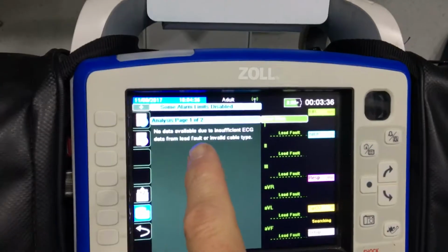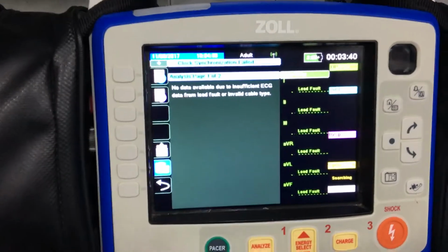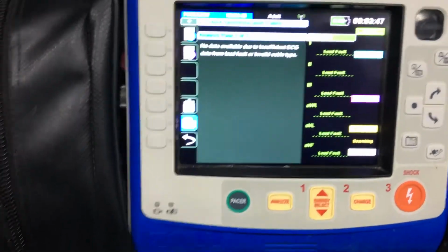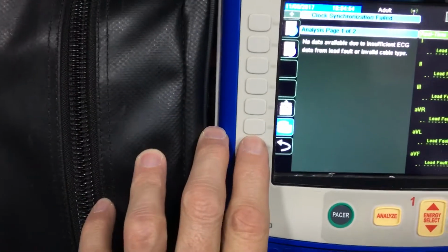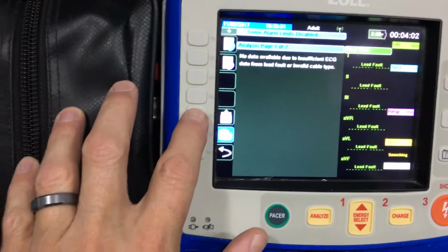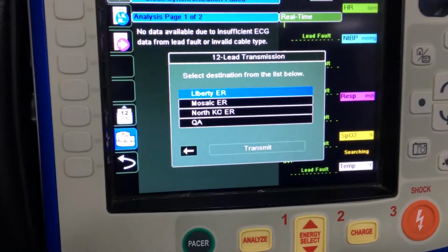So this box here that gives you information on your specific patient, on if it's a STEMI or if it's normal, whatever it says, do not erase that yet. Hitting this button here erases your info screen and just brings up your full 12 lead. If you exit first, you cannot send it. So before you exit out and you want to send this specific one, hit that. It comes up on Liberty ER.